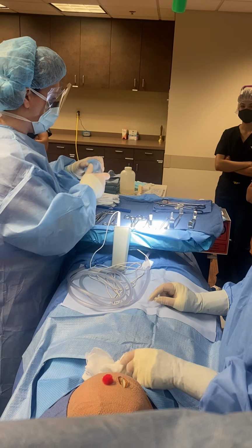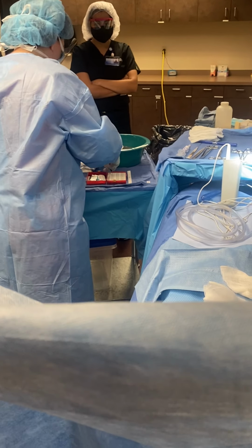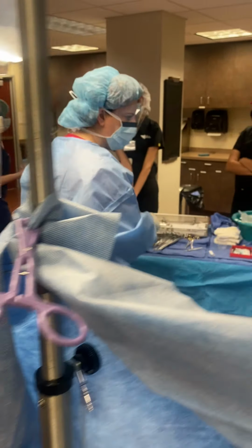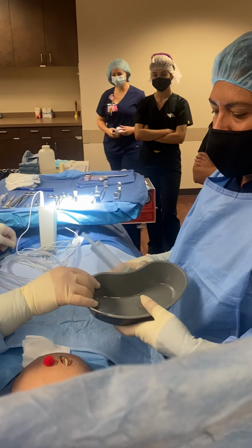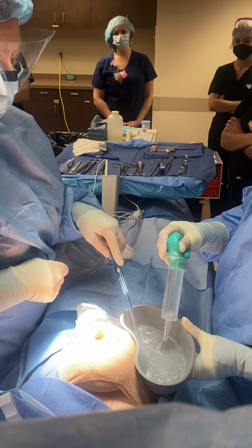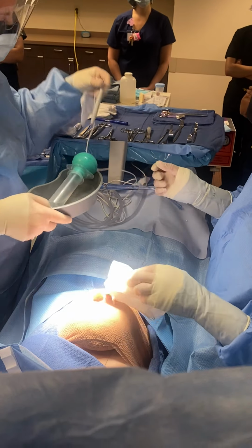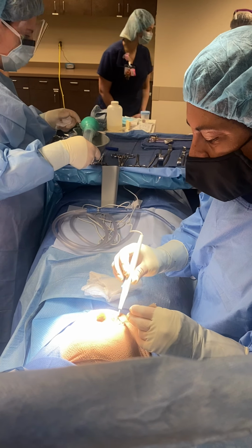We're going to keep her open. Mrs. Stolp, I have a right breast biopsy. The long stitch is anterior and the short stitch is superior. Thank you. Some irrigation, please. You'll run this to the lab? Yes, please. Stat. All right, let's clean her up. That's good enough. Is there a kick bucket there by you, Wendy?